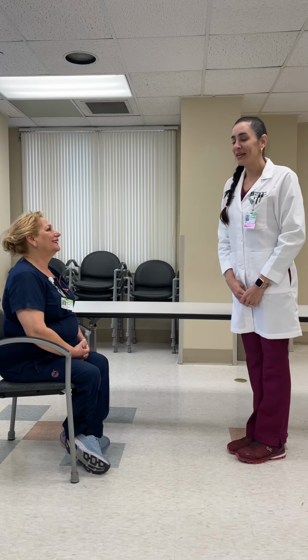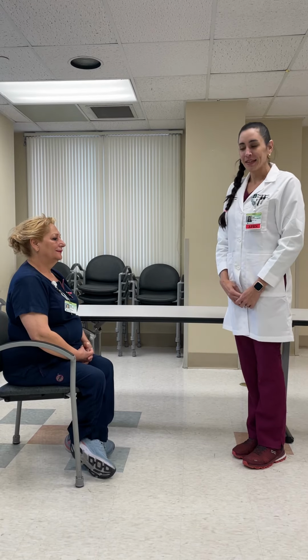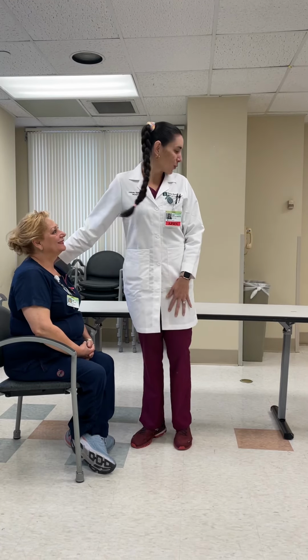Good morning, my name is Lisandra Santos del Castillo and I'm a WOCN student, and today we're going to do a video about stoma marking site. This is my patient, one of the nurses who work with me.